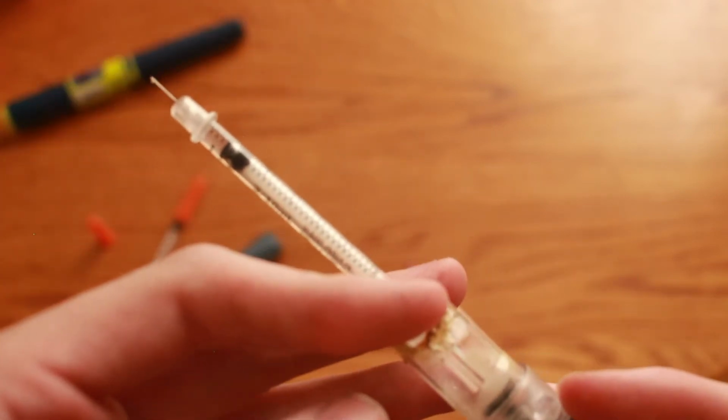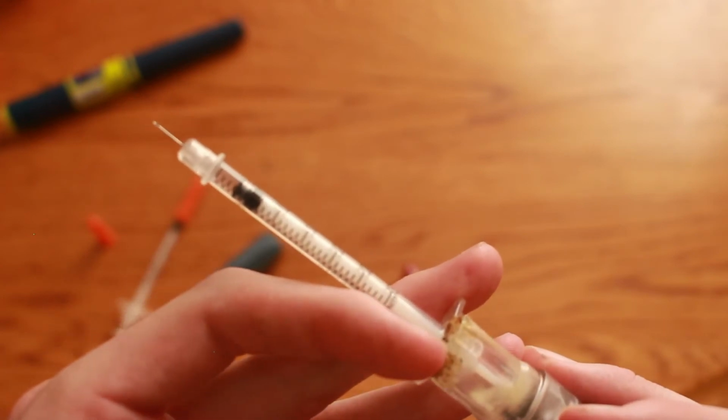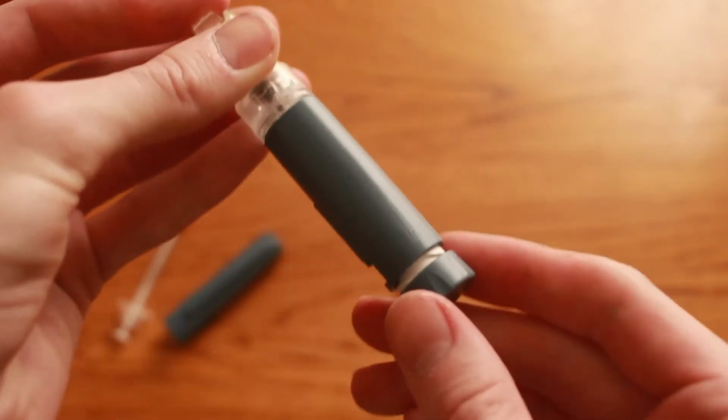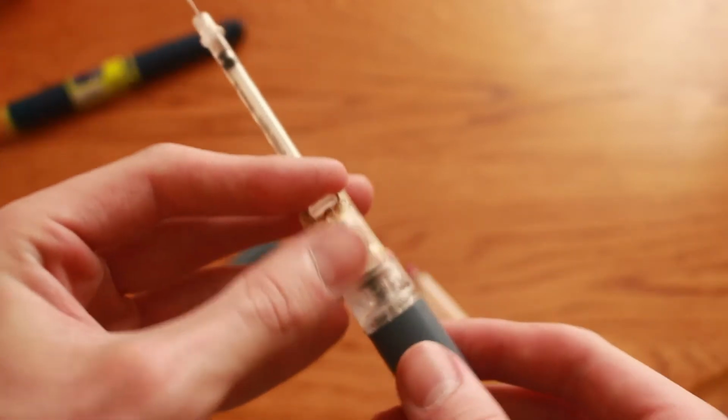And then look at that. It is down now to 3. Isn't that amazing? Literally, 10 units is 1 unit on here. It's literally a 10th. It is so cool.